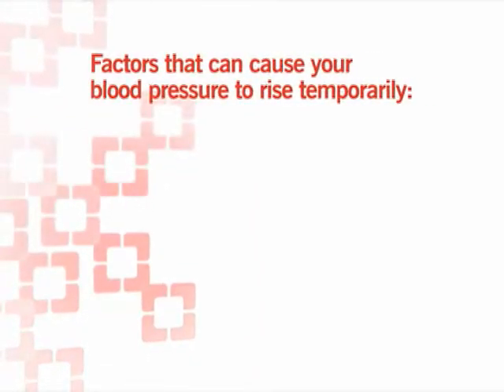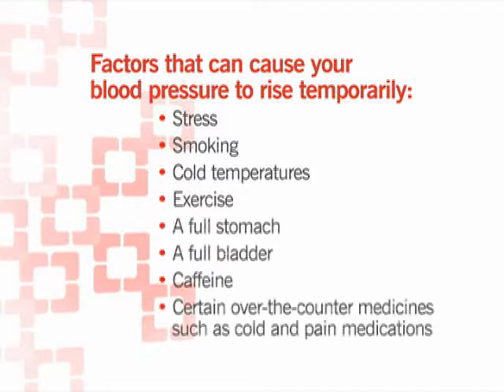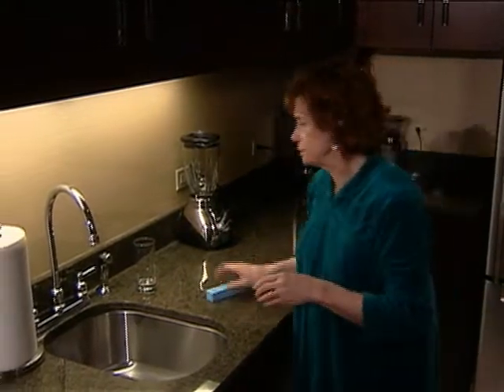To make sure the readings you receive are accurate, you should not measure your blood pressure if you are experiencing stress, have been smoking, have been exposed to cold temperatures, have been exercising, recently finished eating, need to use the bathroom, have recently had caffeine, or have recently taken cold or pain medicines. Take your blood pressure the first thing in the morning before you take any medications, and at night before you go to bed, before you take any medications.